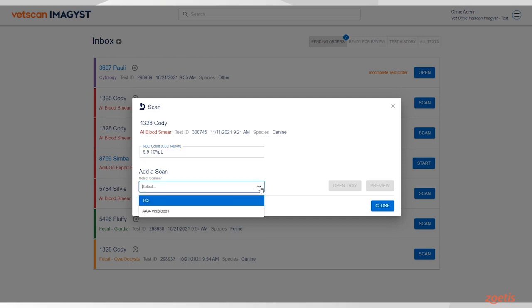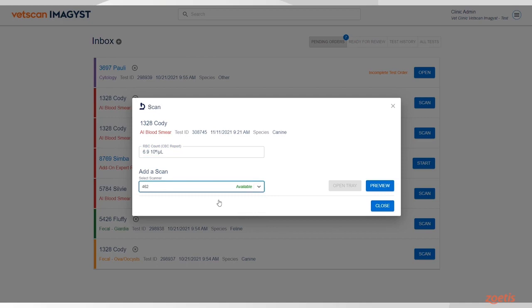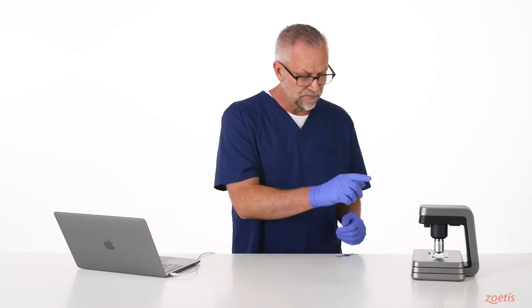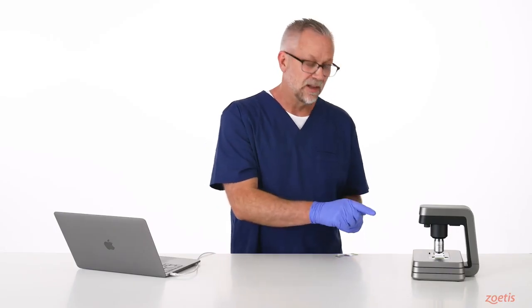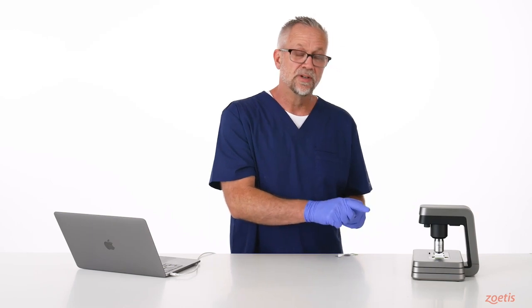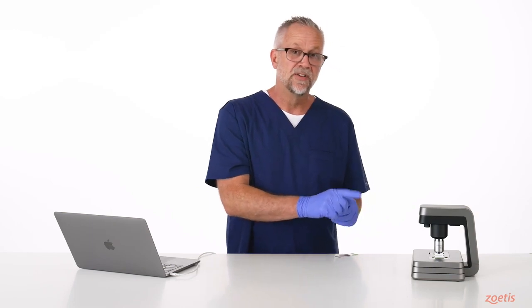Select a scanner, then place the slide on the scanner stage. Now, before you can place a slide, the stage needs to be in an open position.